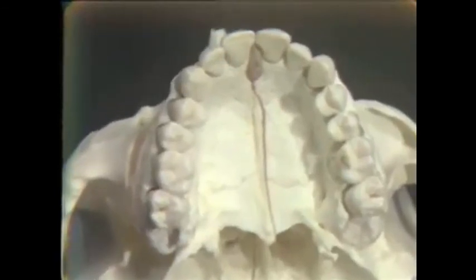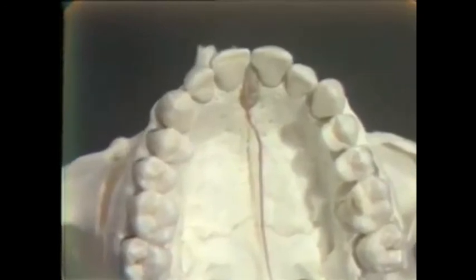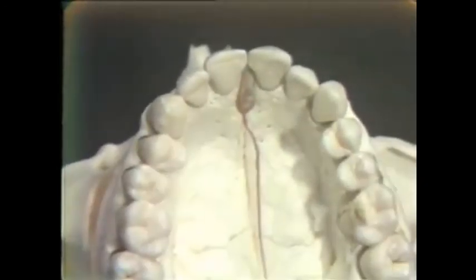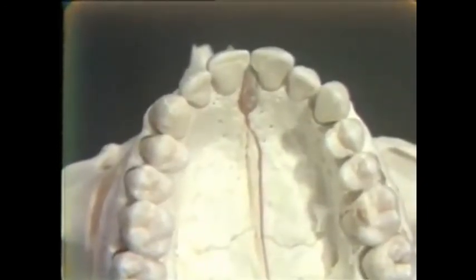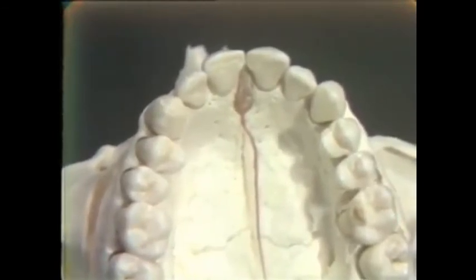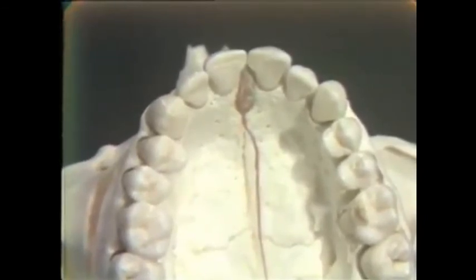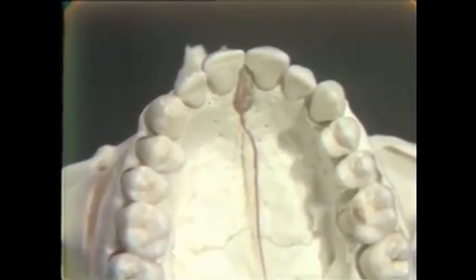And by anesthetizing the nasopalatine nerve, we will again afford anesthesia of all of these anterior palatine overlying soft tissues from approximately cuspid to cuspid areas, which we would need if we were going to manipulate these palatal anterior tissues in any fashion.